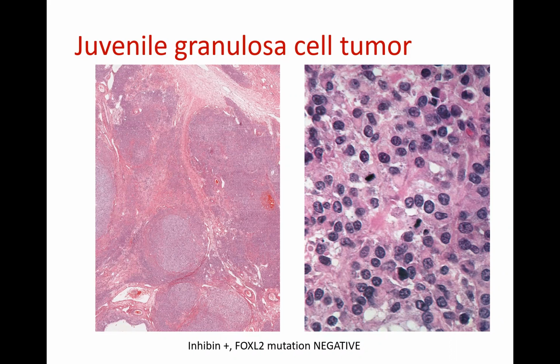Okay, so now I am confused. So why isn't this cancer? Well, the good news is that this is not cancer, because the setting in which you are presented with the case is not one of cancer. This is a young patient. So you are already primed to think in a certain way. This is a tumor. What are my options if you give me this tumor and say this is a young patient, a young 13 or 18-year-old? What are your options? Your options are either a juvenile granulosa cell tumor or maybe a dysgerminoma. We will talk about that next week.